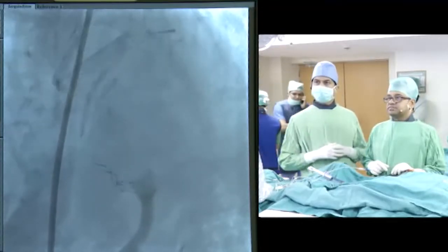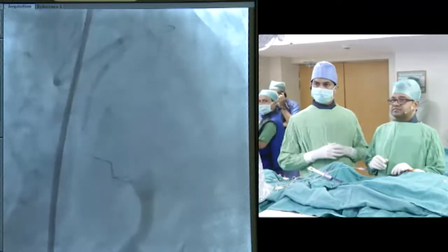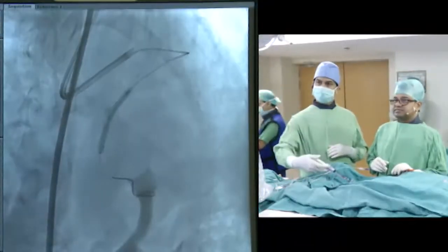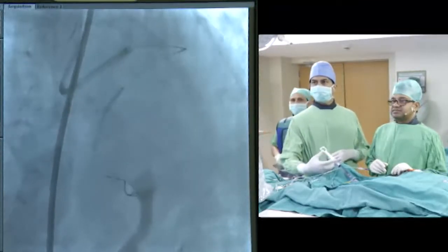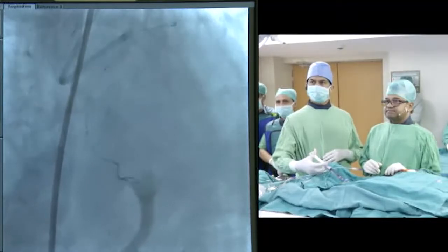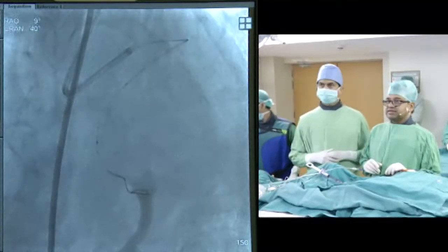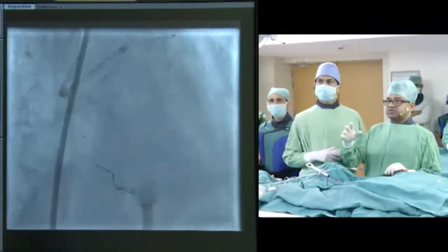This is a very nice demonstration. The patient is also tolerating it very well. Patience with the expansion is needed to make sure that you get full apposition, and you're obviously going to post-dilate this, but we see clearly that it has expanded in the mid-segment where there was a waist. I'll do a stent boost also, just to show the markers.